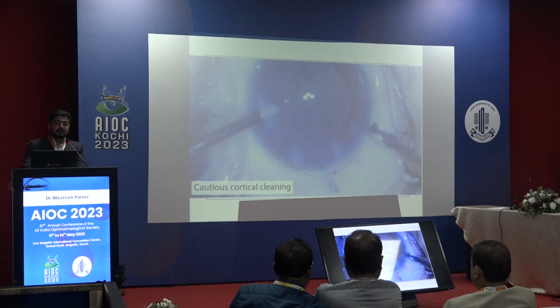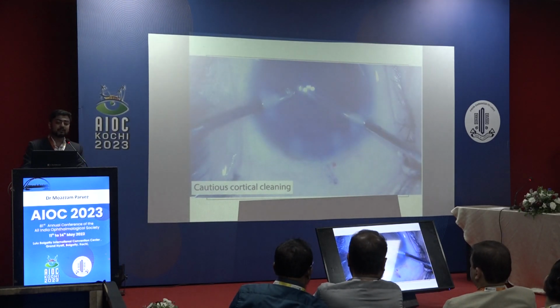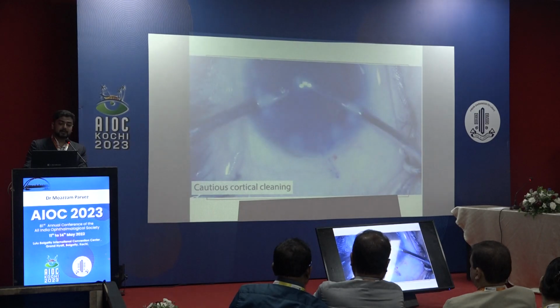The cortical cleaning should be done avoiding any kind of PCR which would further stop us from placing a toric IOL in this particular case.